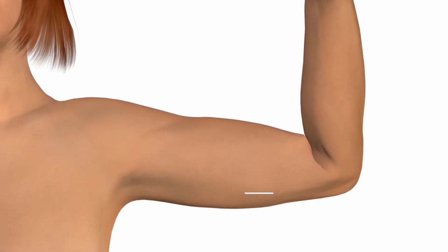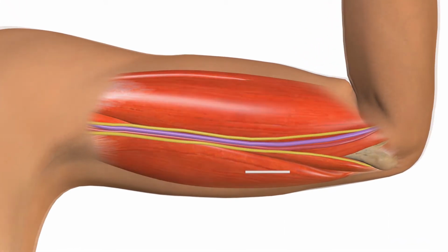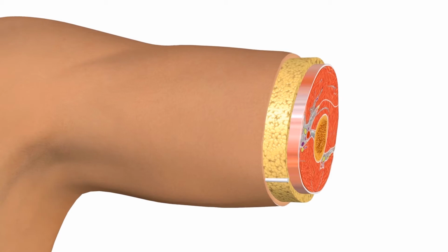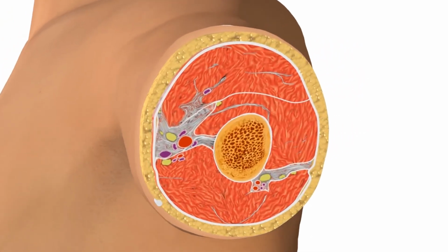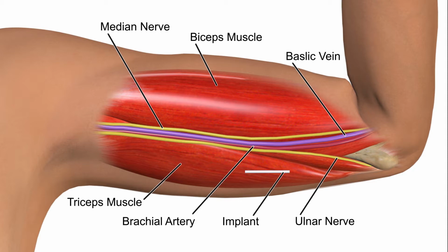The implant should be inserted just under the skin at the inner side of the non-dominant upper arm, about 8 to 10 centimeters above the medial epicondyle of the humerus, avoiding the sulcus or groove between the biceps and triceps muscles, and the large blood vessels and nerves that lie there in the neurovascular bundle deeper in the subcutaneous tissue. To avoid neural or vascular injury, place the implant subdermally no closer than 8 centimeters from the medial epicondyle and not over the sulcus or groove.